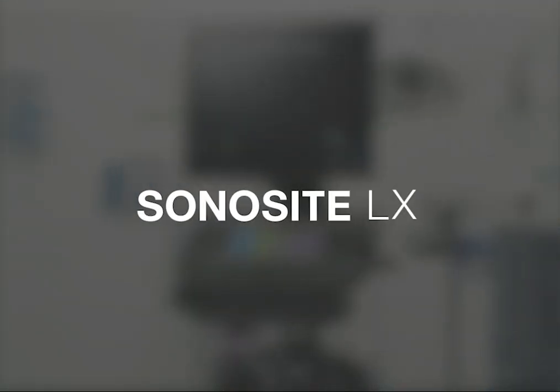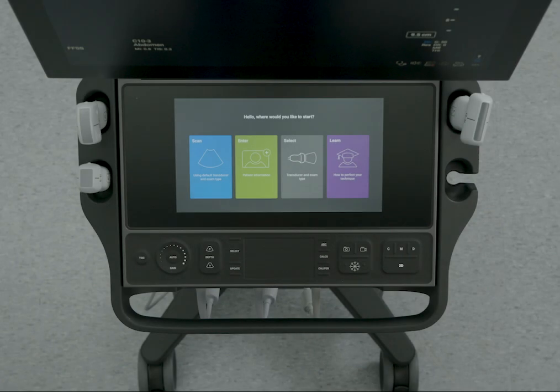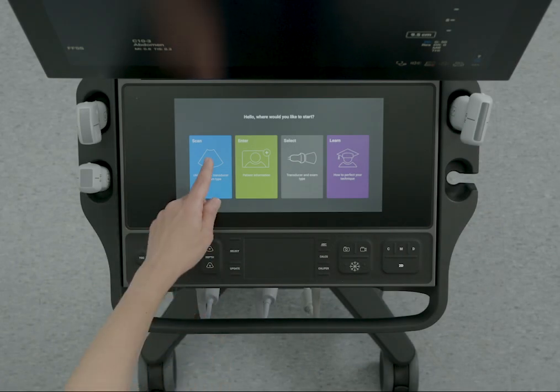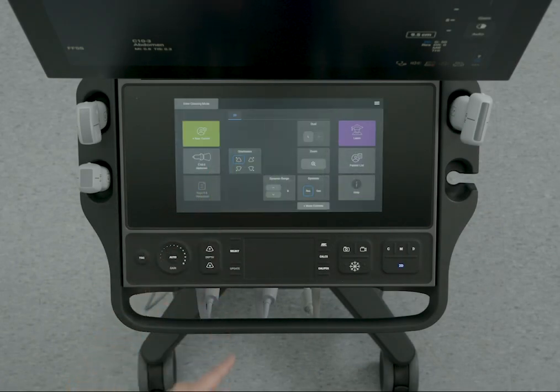Welcome to the System Help video: Performing an Exam. To begin scanning, tap the Scan button on the Startup screen.